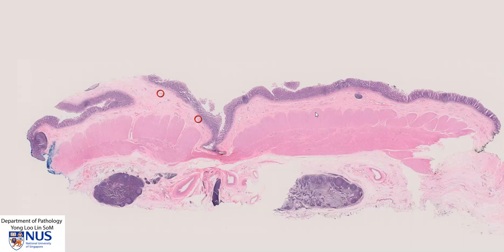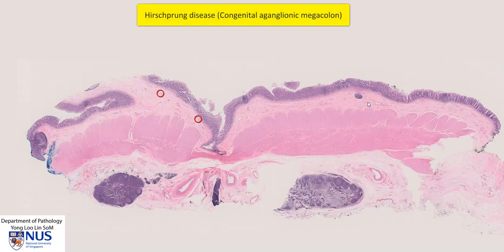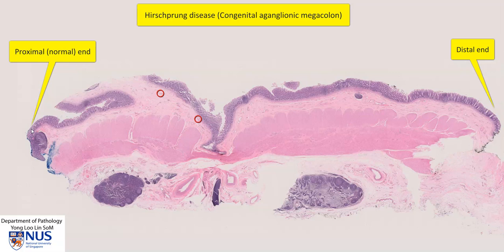Hello, this is a virtual microscopic slide of a length of colon, and this is a case of Hirschsprung disease. On the right is the distal end, and on the left is the proximal end. The distal segment is abnormal and lacks the presence of ganglion cells, while the proximal half is normal, with the presence of normal ganglion cells in the submucosal as well as the myenteric nerve plexuses.